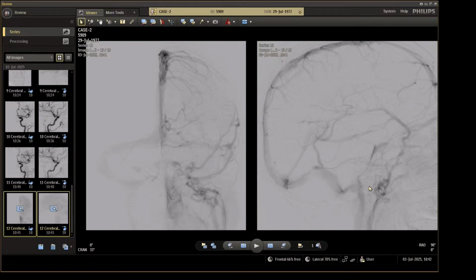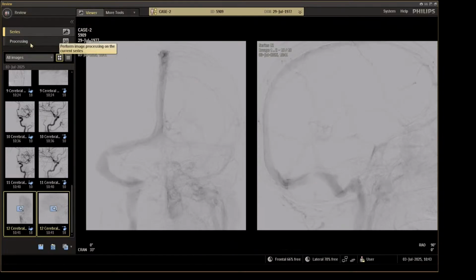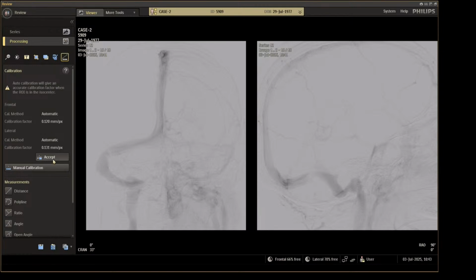It might be a sign of hypertension. Yes, all these additional veins. If we do the angio from the right side, it will be the same. And here is a stenosis, here is a stenosis. There is a diameter difference, and the patient has headaches.